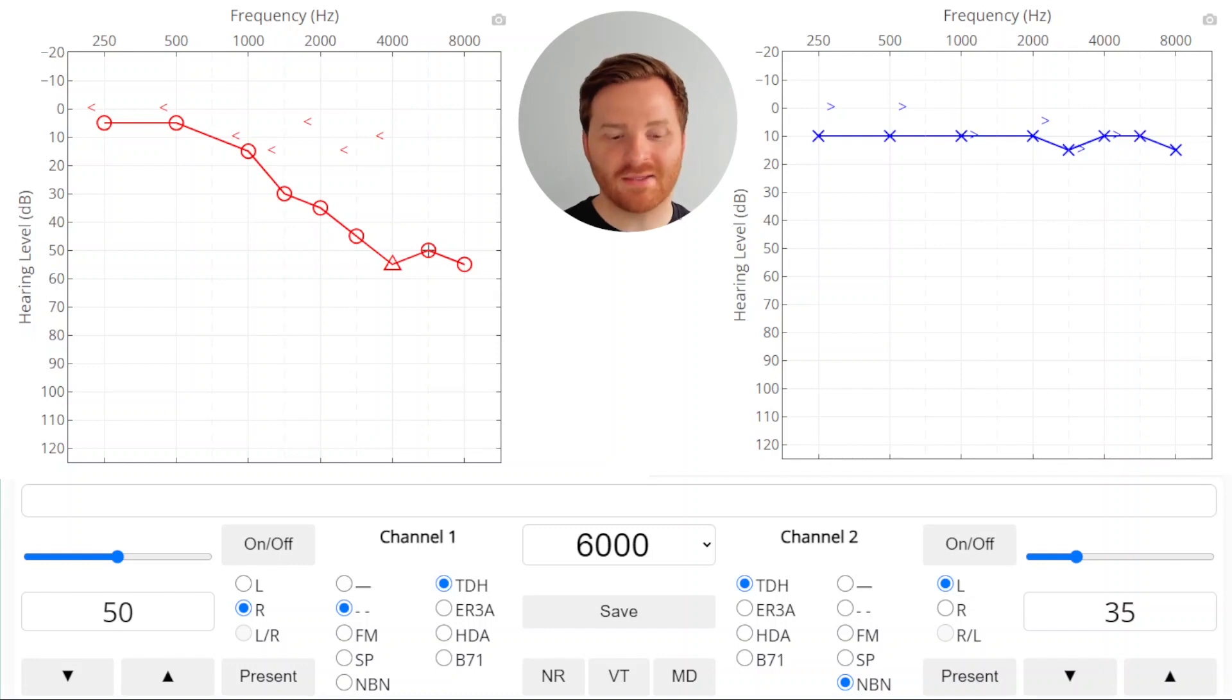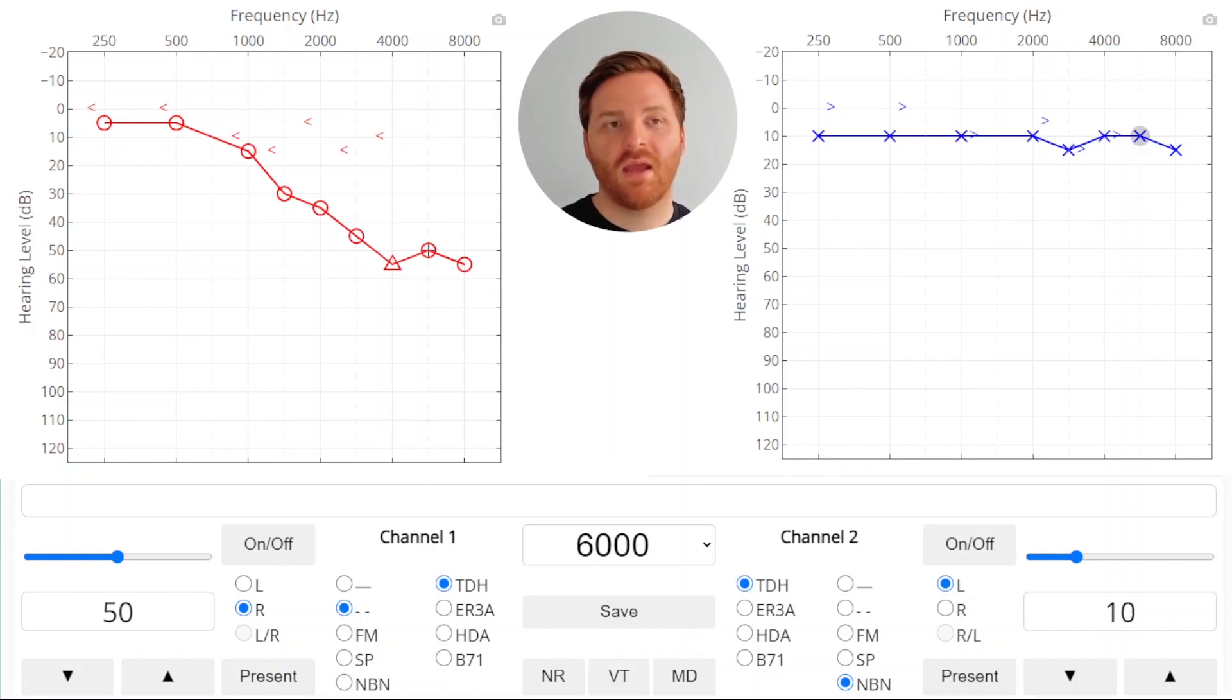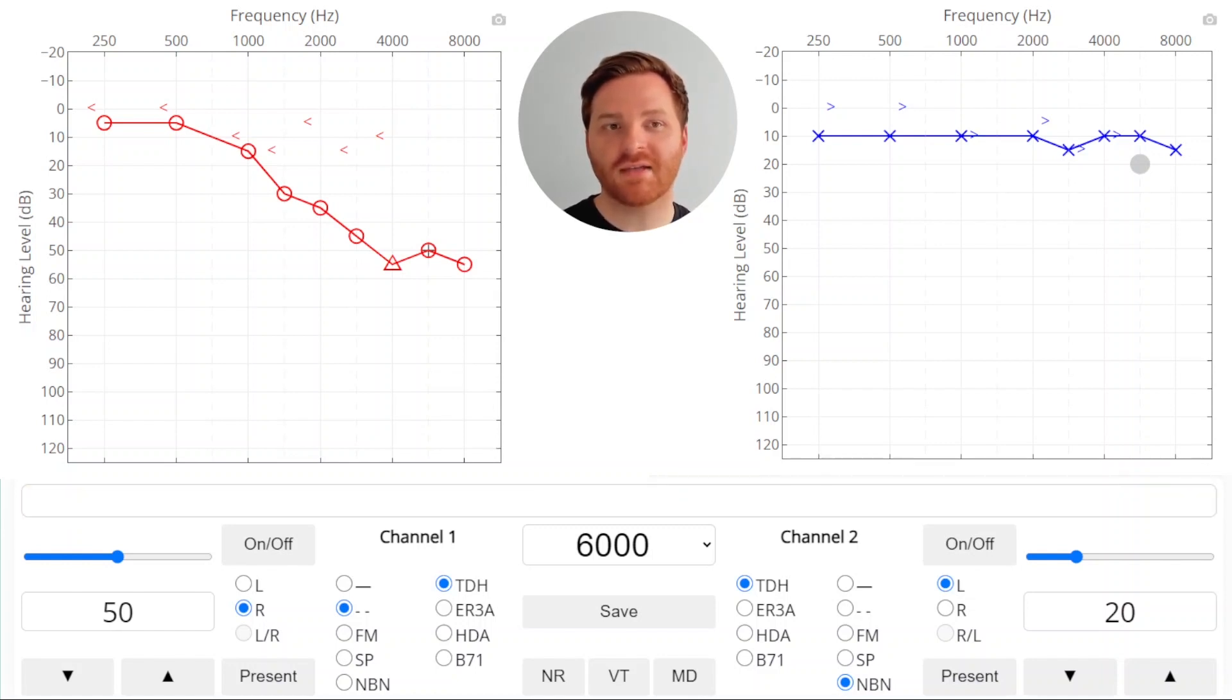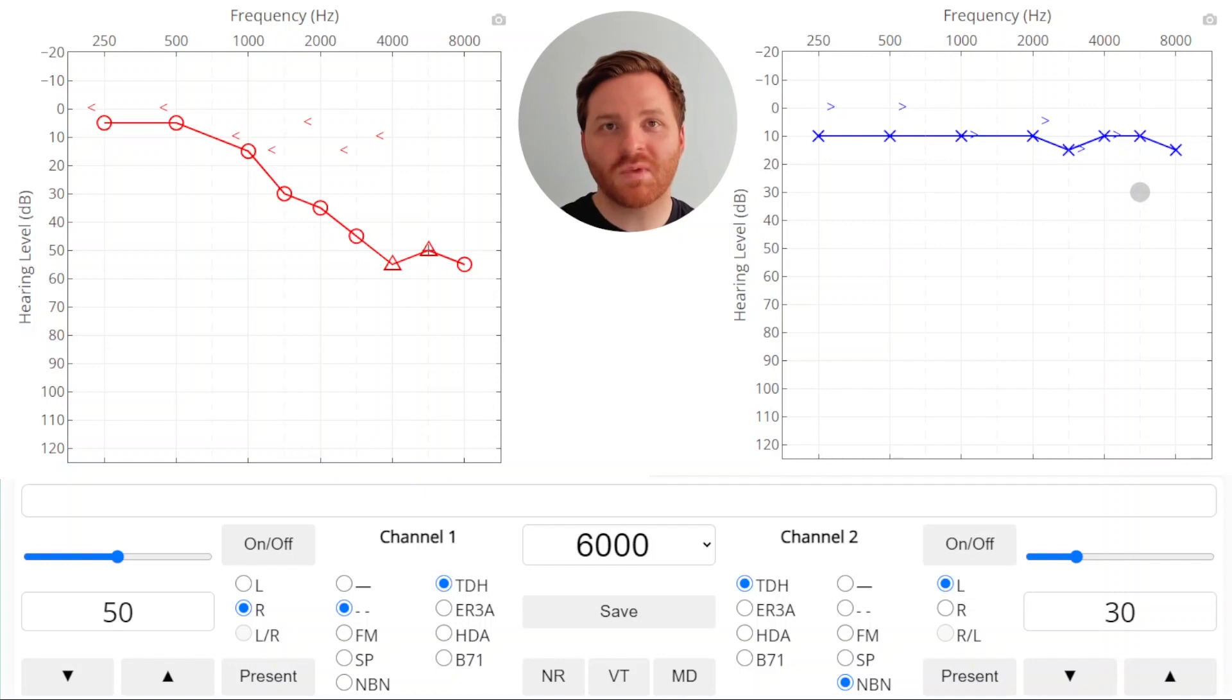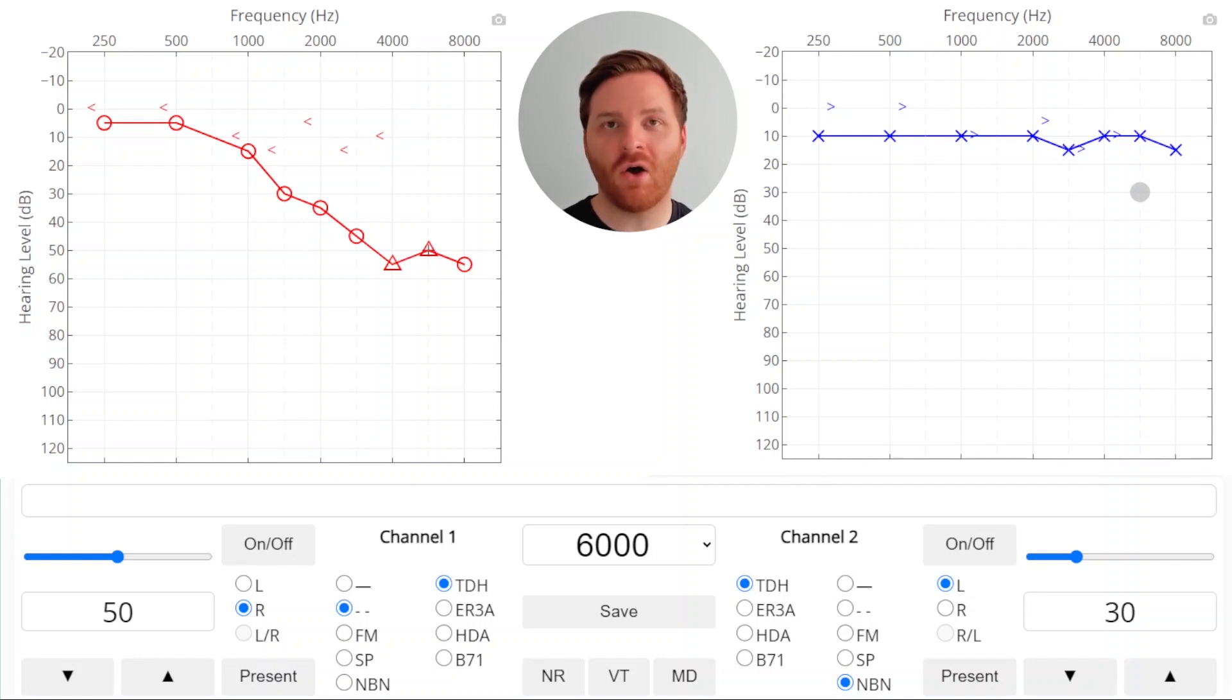So we need to mask. We'll turn on our masker and set the level to the air conduction threshold of the non-test ear plus a 10 dB safety pad. We'll present our stimulus and we get a response. So we'll raise the masker, response, raise the masker, and we got three responses. So we'll go ahead and save this as our masked threshold. In this case, our unmasked threshold was the same as our masked threshold. But the difference is we can feel more confident that the non-test ear wasn't involved at all during this testing. And our reporting of our results is more accurate.